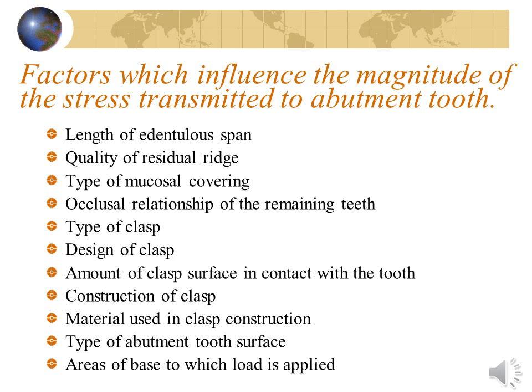Next is the abutment tooth surface. The surface of a gold crown or restoration will offer more functional resistance to the movement of a clasp arm than enamel. Therefore, more stress is exerted on the tooth restored with gold than on the tooth with intact enamel.